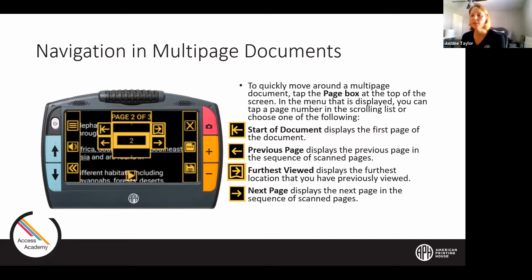because it's reading to you what's on the screen, which is really helpful for me, particularly. I may struggle to see where the play button is exactly, so I can kind of find it first and know, okay, I'm on the play, so I hit that button to make it play or pause. So it'll tell you if you're not sure, like, what does this arrow do? You just tap it and it'll tell you what it does. So it's really helpful.